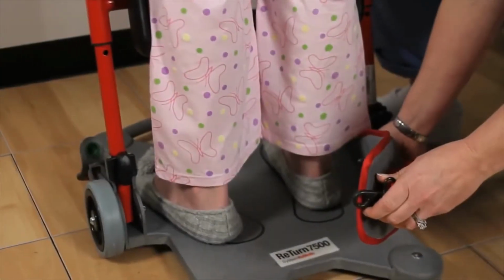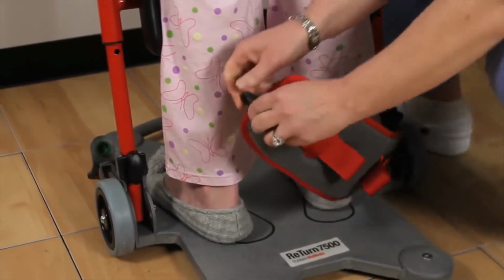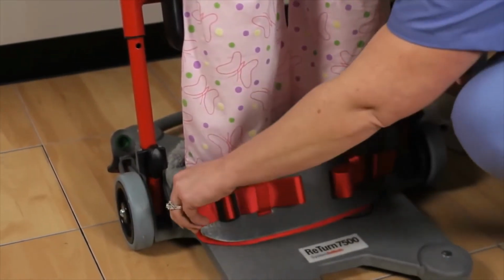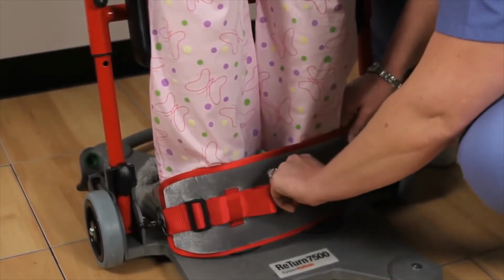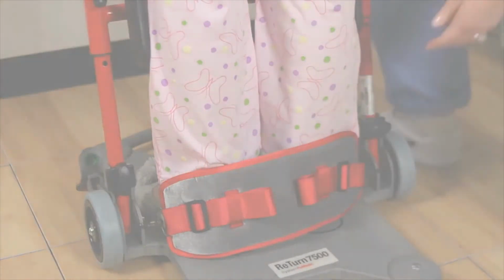Some patients are unpredictable and may step back off the return base. The heel strap is an accessory that is used to safely keep the patients on the base of the return. Do not use the heel strap without using the return belt.